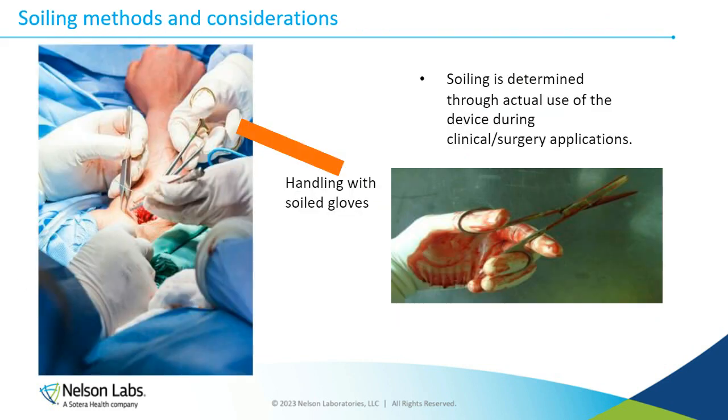Now, this gives you a good example and a visual. You can see that the hemostats are just being used on probably 2 inches of the proximal end, just to help tie the suture. But if you see how I've soiled it, it's probably all of it. So it's very important that in case it falls or gets dirtier, we have validated the worst case, right? Obviously, we don't want to overdo the worst case, but there is that factor that we do take in for validations.